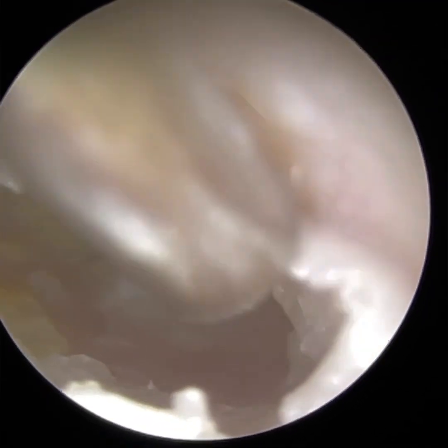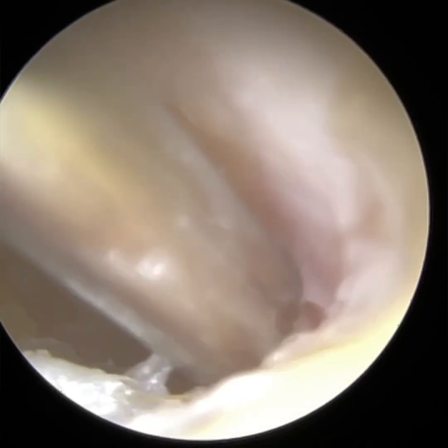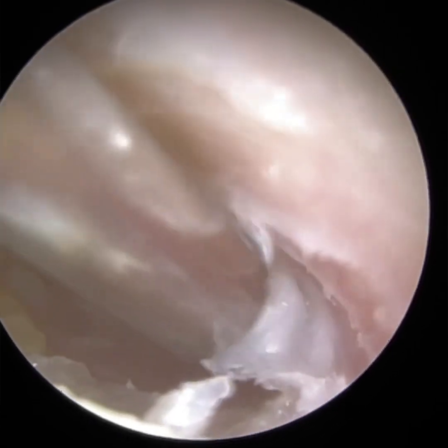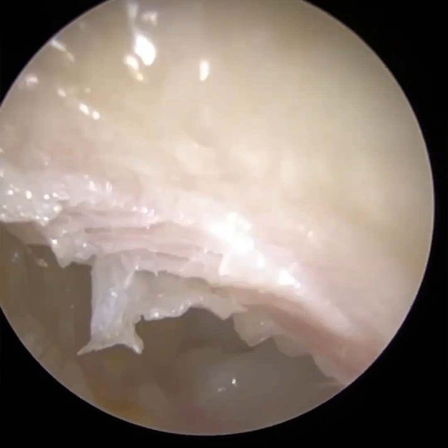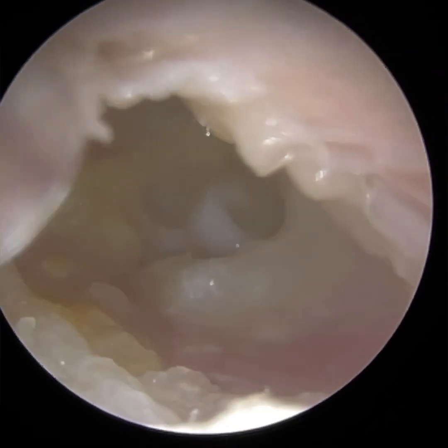When you first examine this patient's ear, you may be easily mistaken to believe that this patient has got an outer ear infection because of all this purulent discharge that's collecting in their ear canal. However, all of this purulent discharge is actually originating from behind the patient's eardrum in their middle ear, and it's seeping and weeping through their grommet.